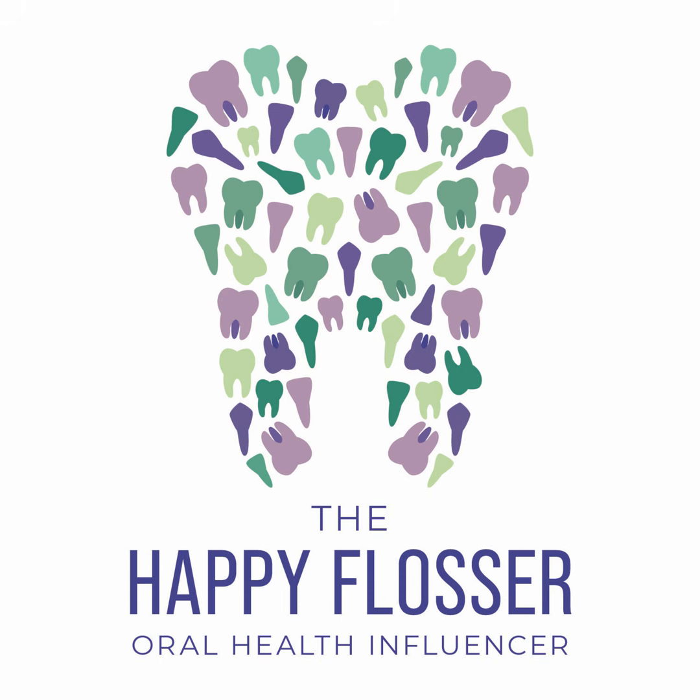You also want to educate your patient on why radiographs are necessary as part of the assessment phase of treatment in order to properly diagnose and treat anything that might be going on, potential risk for your patient. Answer questions that your patient has about the reason for radiographs, and you will find that of all the things that you do in the clinical operatory, radiographs is probably the one you'll have the most conversation about.